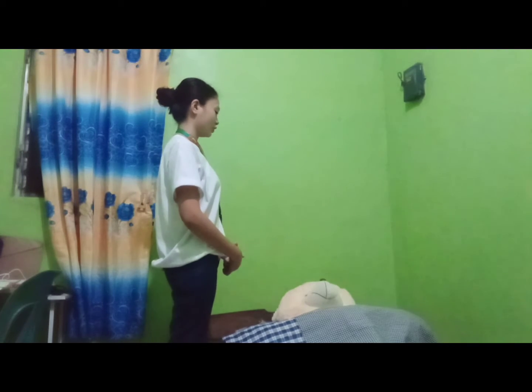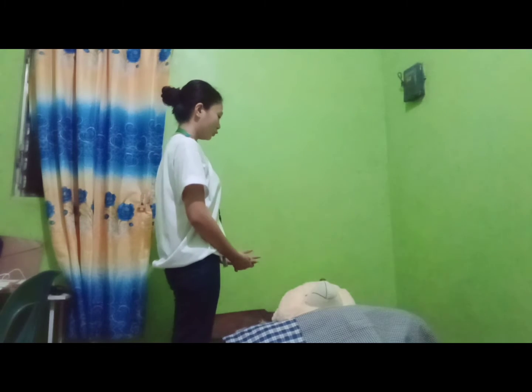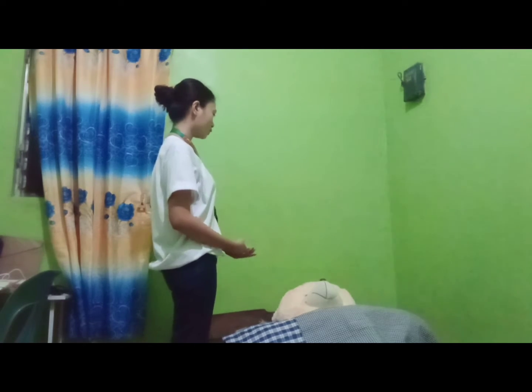Good day, sir. I'm Tia Joy Arojo, your student nurse for today. And for today, I will be doing your suctioning of secretions from airways, and the purpose of this procedure: first, remove excess mucous secretions to maintain patient airway. Second, collect sputum or secretions for diagnostic testing.